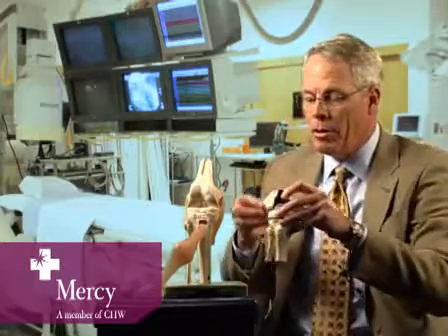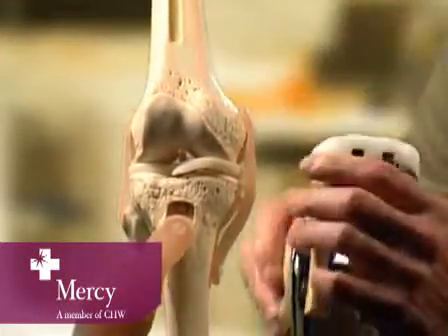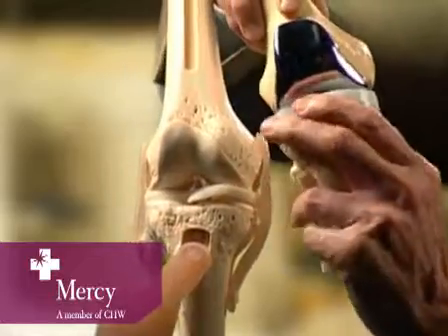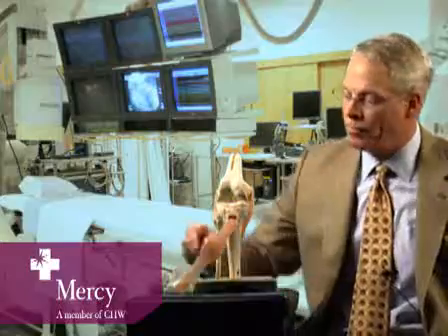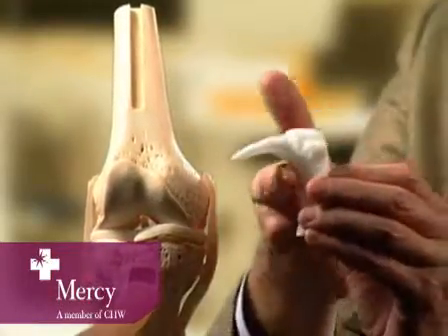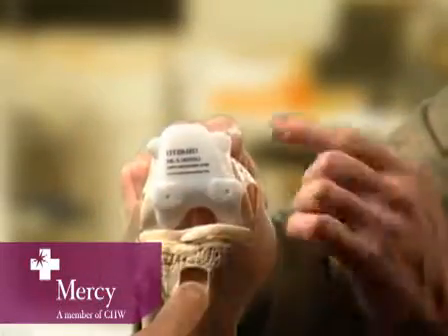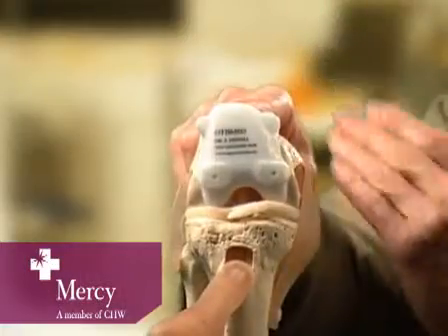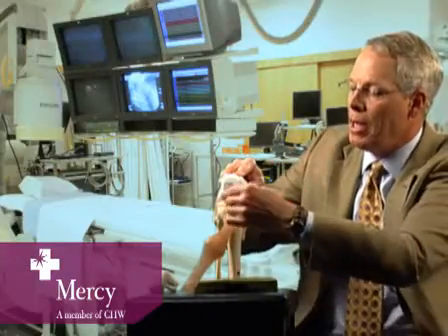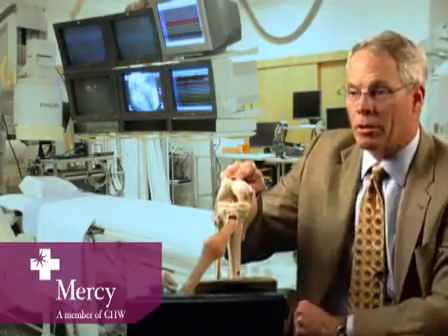When we plan in the computer for the custom fit knee, we make a model that looks just like this, with the parts properly positioned. What we need to do is transfer this position to the actual knee. The way we do it is with a guide that's machined to fit right on the back — just like a mouth guard fits your mouth and not somebody else's. This actually fits the patient's specific knee. There's a saw slot here that tells me where to make the cut, and a couple of holes get drilled in to set the position of the femoral component — the part that goes on the thigh bone.